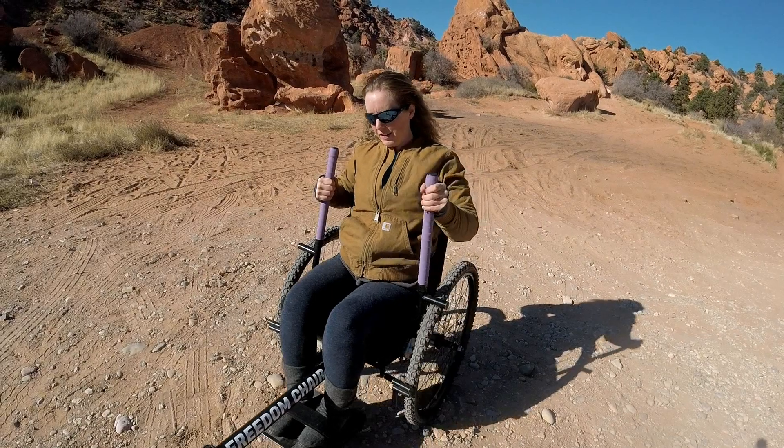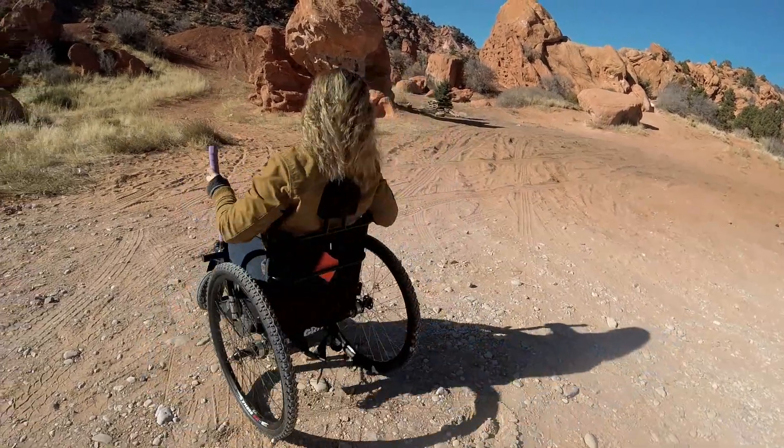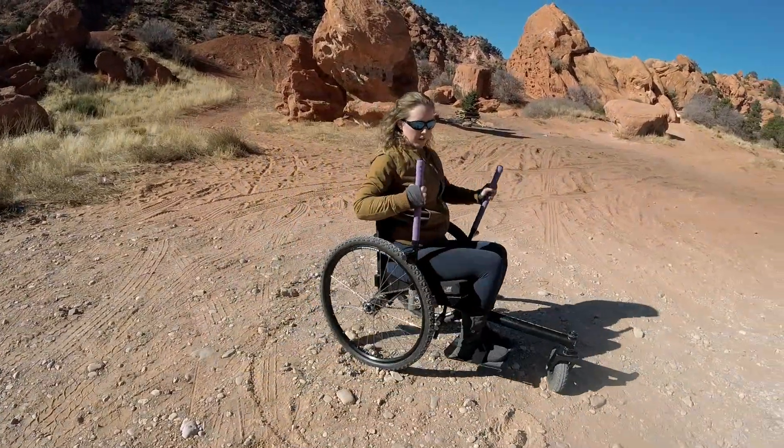Another of the most common questions I get asked is how do you steer and brake? Again, the answer is in the levers. Steering is actually similar to a standard wheelchair — you hold one tire and push the other. Although, in the case of the levers, you pull back one lever, which holds the tire, and then push with the opposite one.